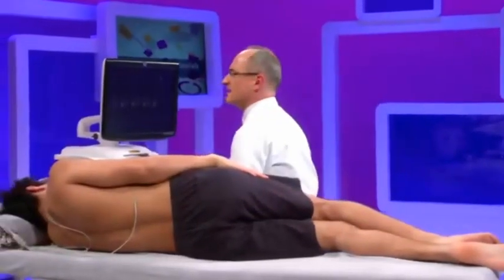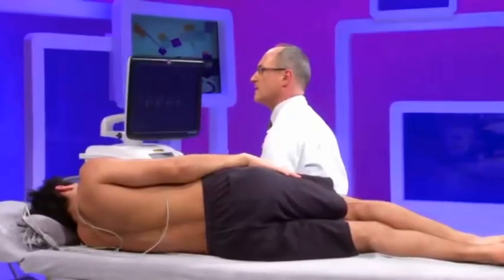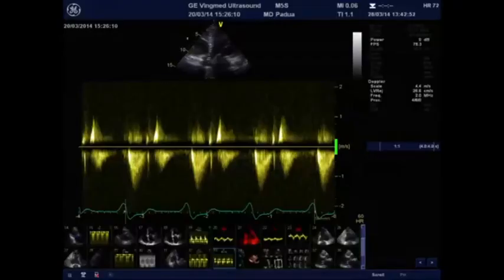We have seen that there is tricuspid regurgitation. There is a pacemaker crossing the tricuspid valve. So one of the questions is the origin of the tricuspid regurgitation. This is not a main issue in this patient because the tricuspid regurgitation was really mild, but sometimes you have a moderate or even severe regurgitation, and you are wondering what is the cause of the regurgitation.